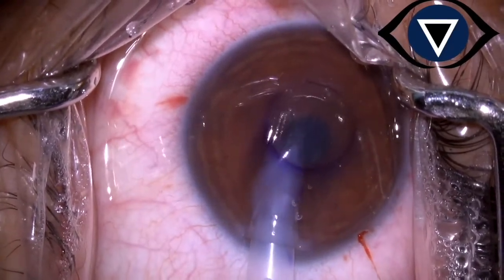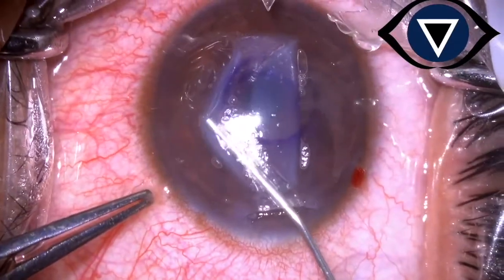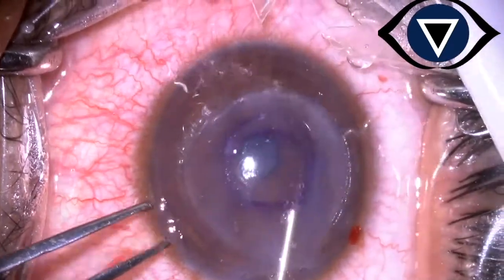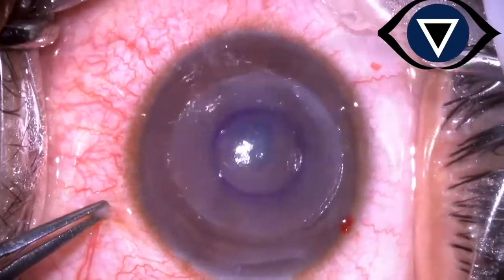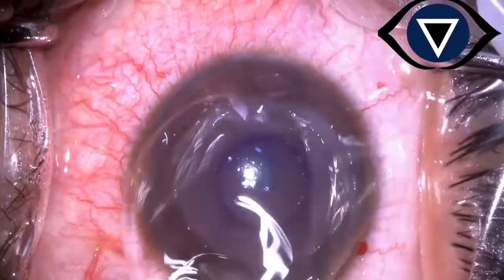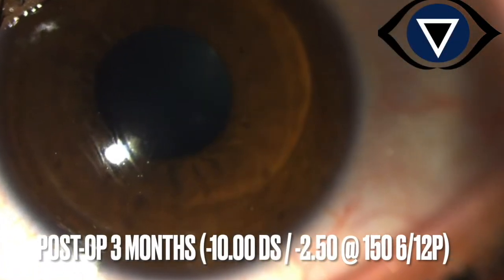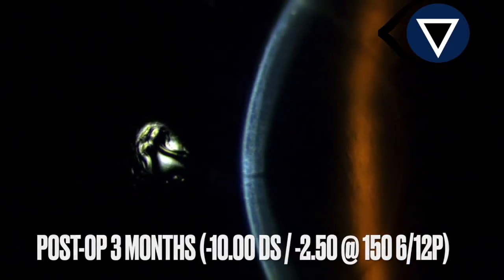Here we can see that the inlay was inserted in the stromal pocket of the recipient with the help of an IOL injector. The inlay was opened up in the stromal pocket and centration was ensured with the center of the patient's pupil. Surface massage was done to ensure the centration of the inlay. Here we can see the post-op 3 months image of the patient where the inlay can be seen well in the center and there is no inlay edema.